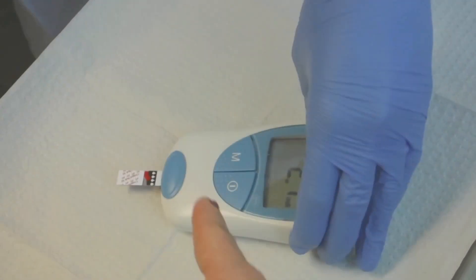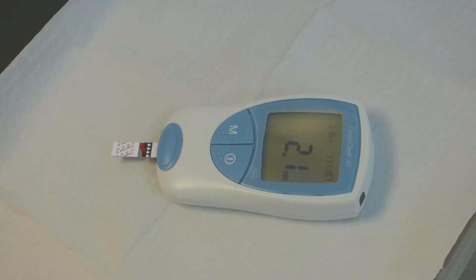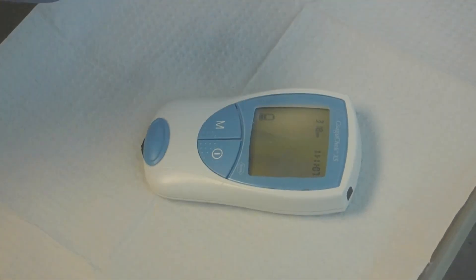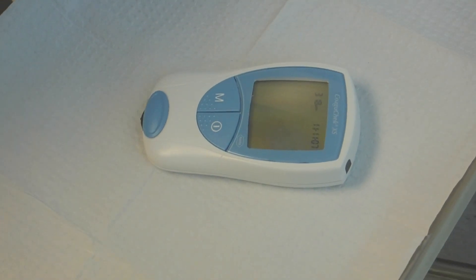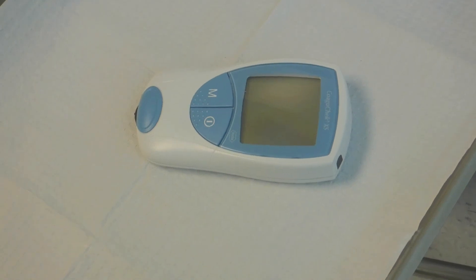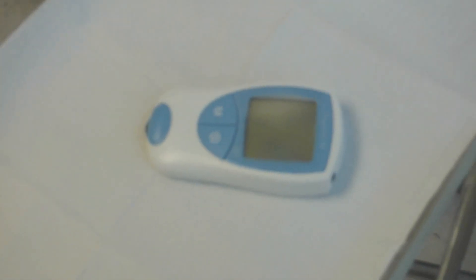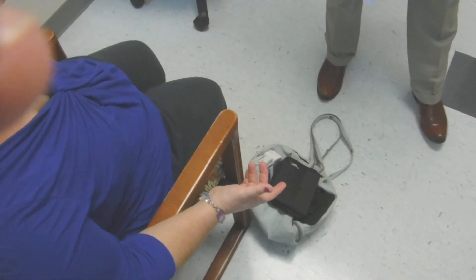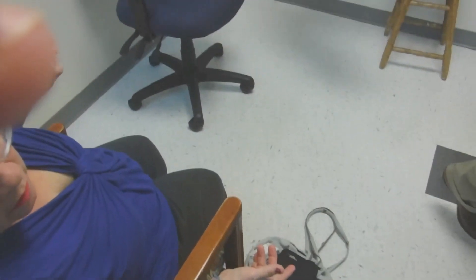Now how come that says 2.1? Well, because there is some variability. Really? That's why you said it was lower. How do we know if the other one is accurate? Well, it's accurate to a point. People have gone and had the blood draw done too, and I've had them compared.